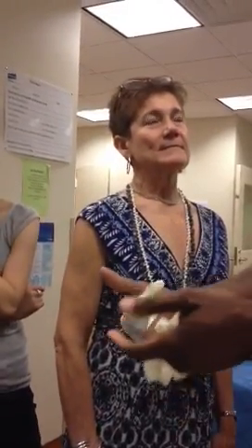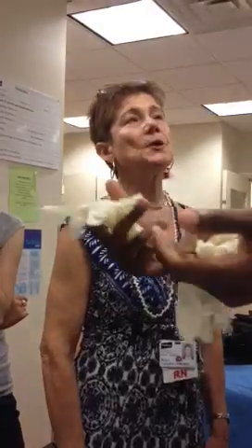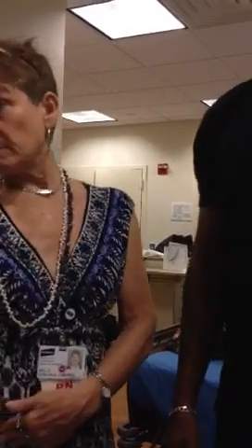When you go in the building you just take... We're supposed to be prepping meds in the med room. We can't go in the hallway with your gloves on and everything. But put them on at the bedside, before you feel, before you find your landmarks. That seems to make sense, right?